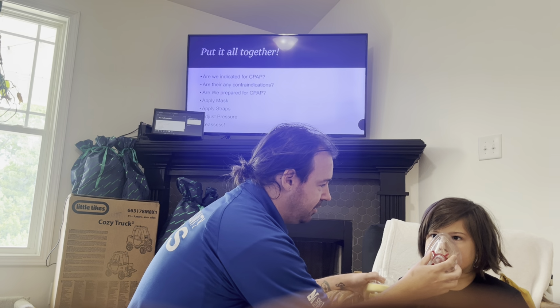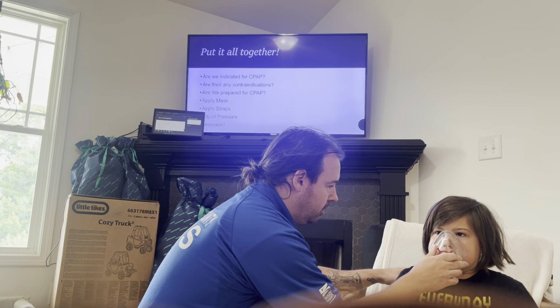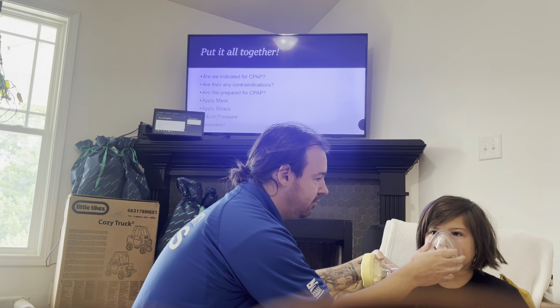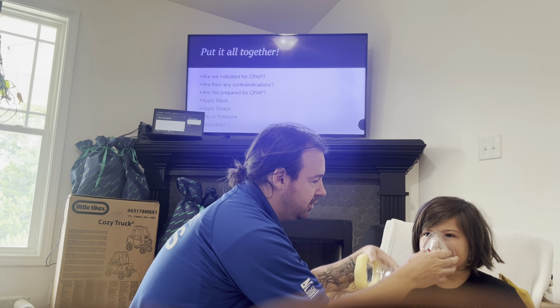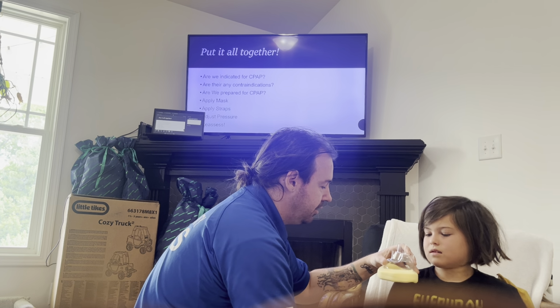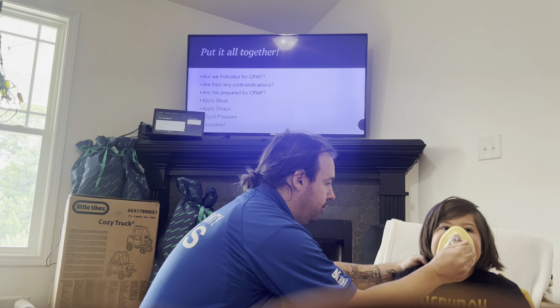right? How's that feel? Can you blow against it? Go ahead. Yeah, see? We can notice, even with covering the hole, as he blows, it doesn't fit him all that great. We're getting some leakage up around the nose. This is probably too big for you, right? Let's try this one. See, now I can push down. Go ahead, breathe more.